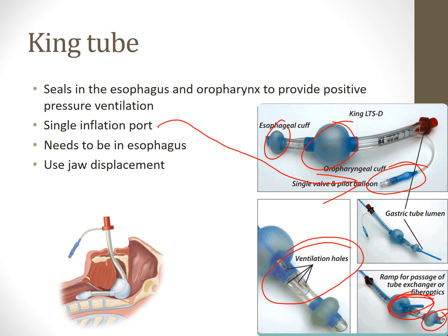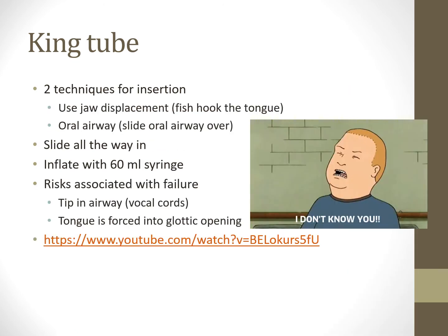Love the king tube, purposely put in the esophagus, as long as the patient doesn't have anything that would cause any risks. I think it's a great option for people that do not have a lot of intubation training.